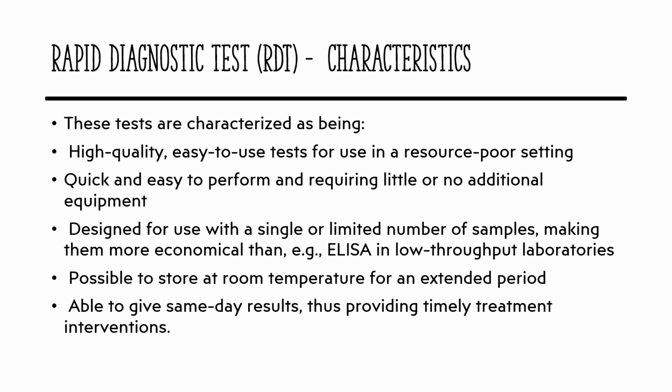Characteristics of rapid diagnostic tests. These tests are characterized as being high quality, easy to use tests for use in a resource-poor setting, quick and easy to perform and requiring little or no additional equipment, designed for use with a single or limited number of samples, making them more economical than ELISA in low throughput laboratories, possible to store at room temperature for an extended period, and able to give same day results, thus providing timely treatment interventions.